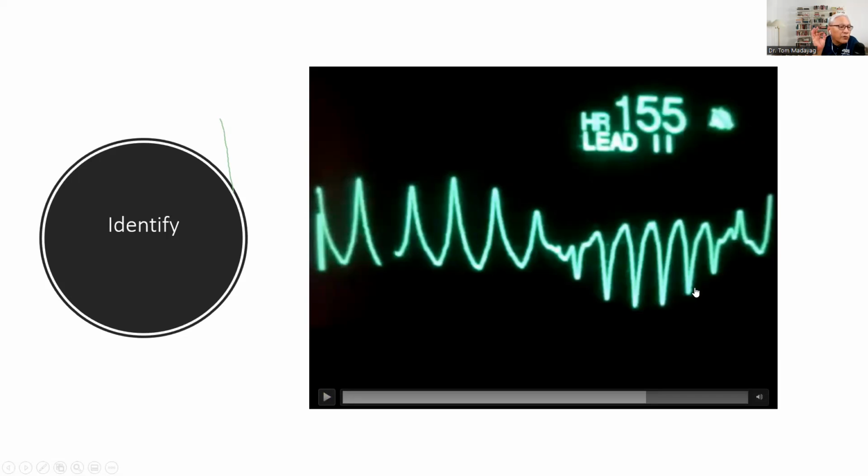And that is why, remember this, in this form of ventricular tachycardia you do not cardiovert, you defibrillate, because if you put the machine on cardioversion mode, it will not be able to detect the QRS complex consistently. Therefore, the appropriate treatment for torsades de pointes is going to be defibrillation. Okay? Any questions as far as this is concerned?